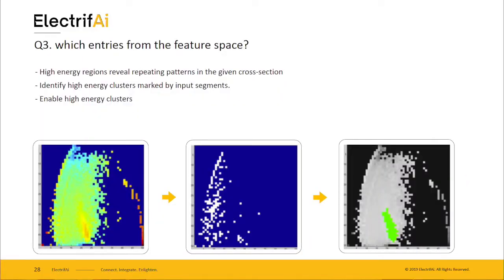And as I mentioned before, once you're given such a cross-section, or the entirety of the feature space, you can have several advanced and smart algorithms to extract that cluster, which pretty much mimics what we've seen in Ross Girshick's Fast R-CNN and Mask R-CNN algorithms, the region proposal module over there.